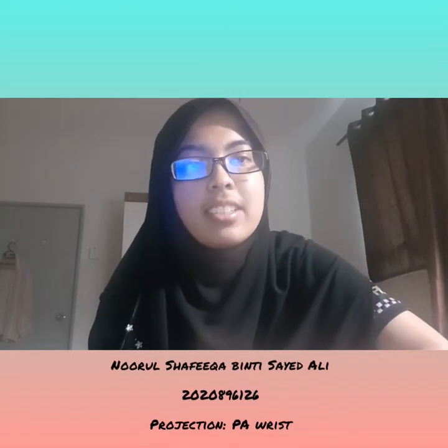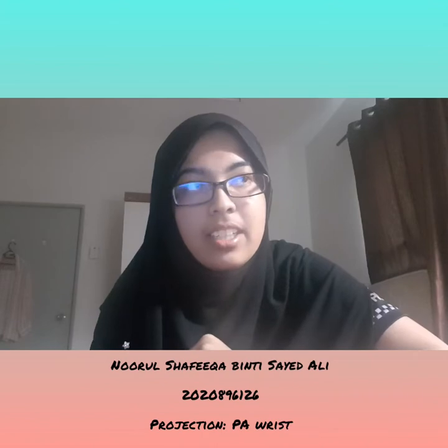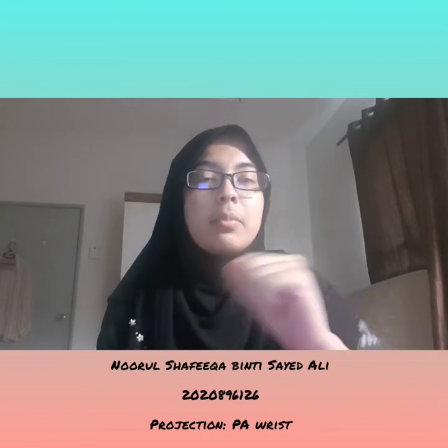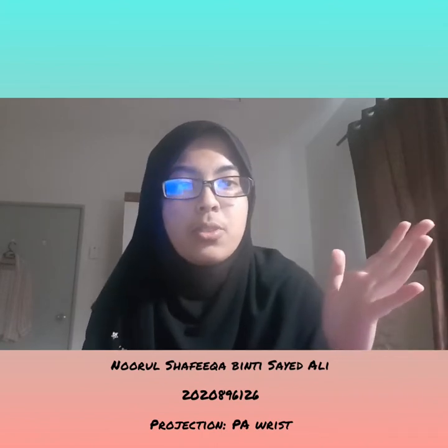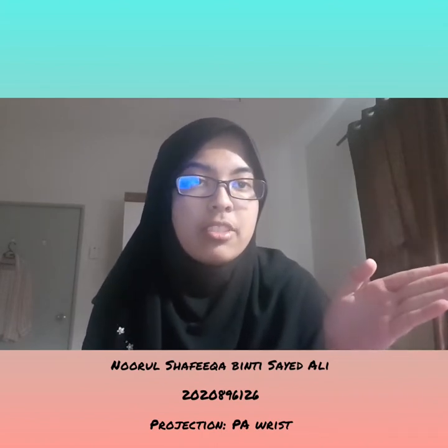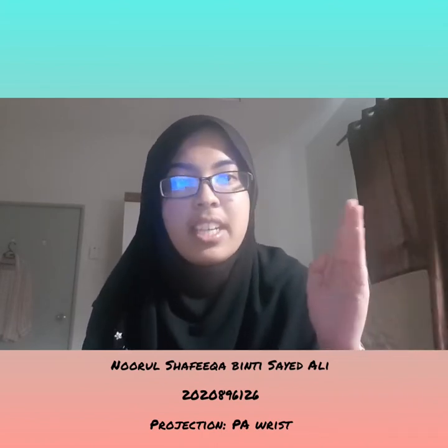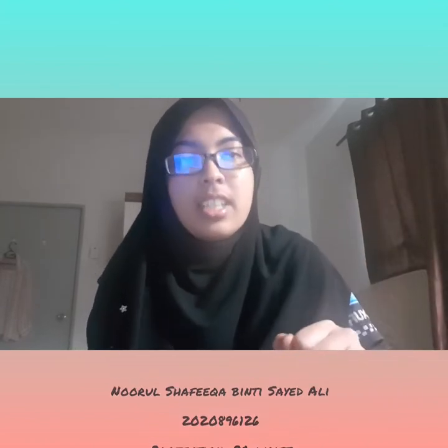Assalamualaikum and hello. My name is Nur Shafika binti Said Ali and today I'm going to show the projection for PA wrist.